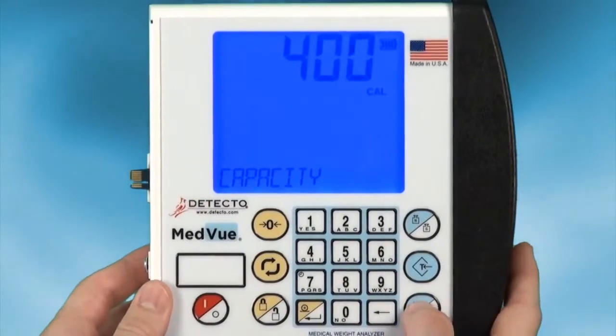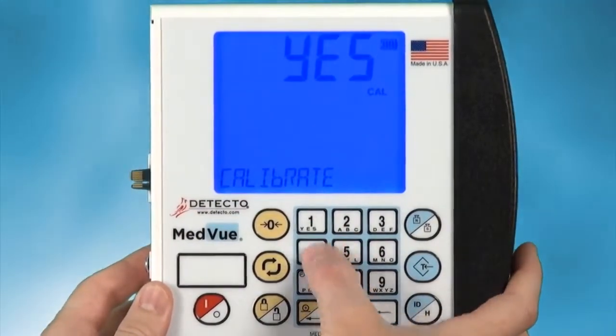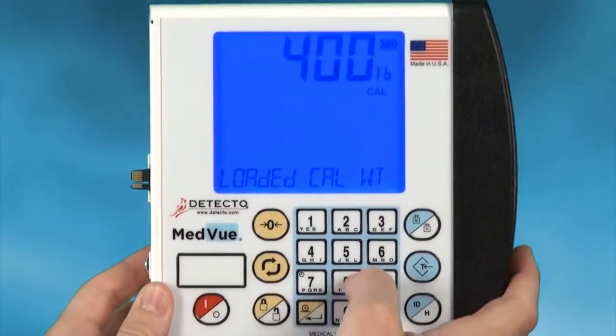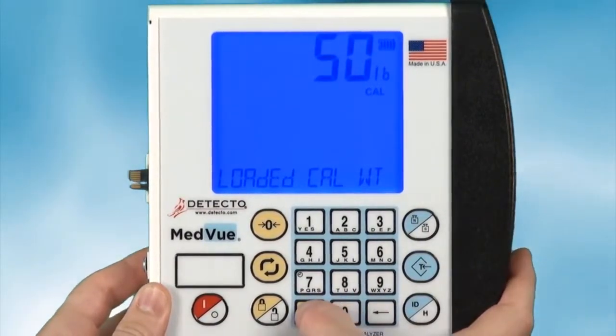Within the setup menu, navigate to the calibration option and select it. It will prompt you to load a test weight onto the scale. Ideally, a test weight should be approximately 50% of the scale's total capacity.